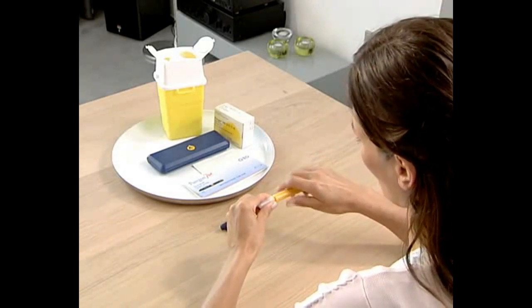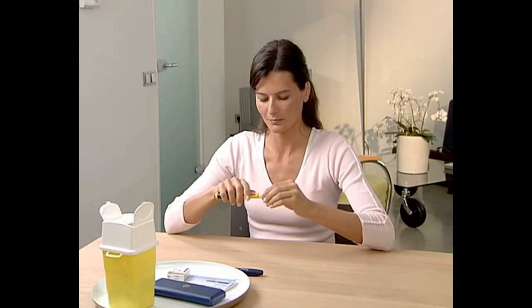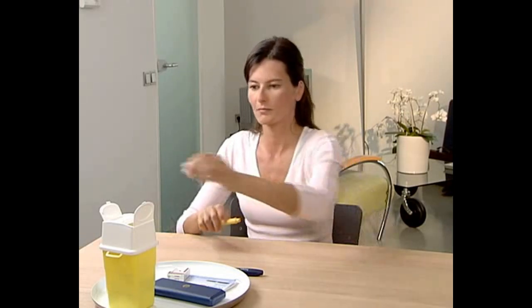Grip the shield and use it to unscrew the needle from the pen. Place the needle in the disposable bin to avoid accidental injury.